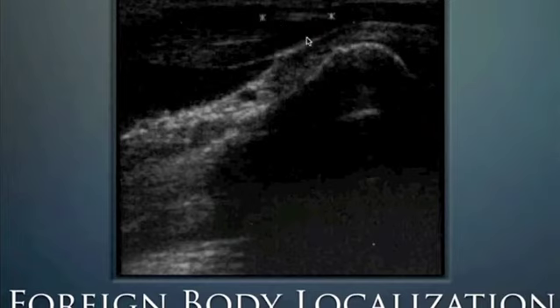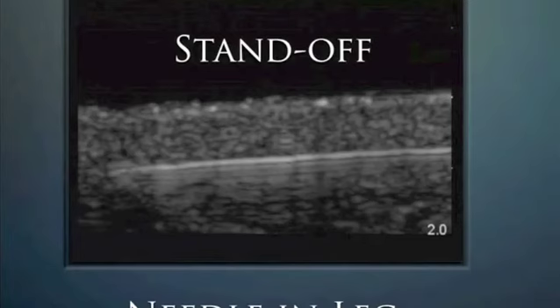And then number three, there is the analgesic part of the lidocaine that makes it more comfortable for the patient. Now this is a needle that was in someone's leg. Very clearly shows the reverberation artifact, these equidistant lines that come down towards the bottom of the screen.